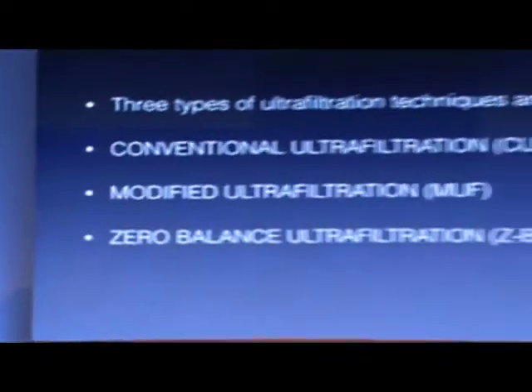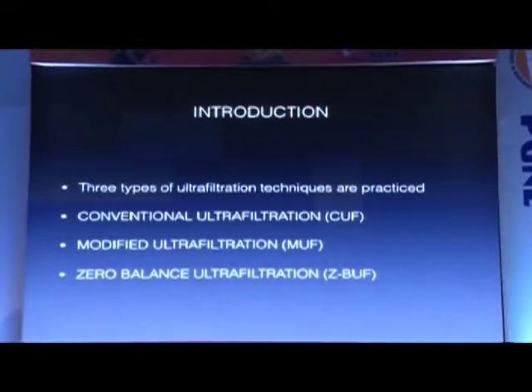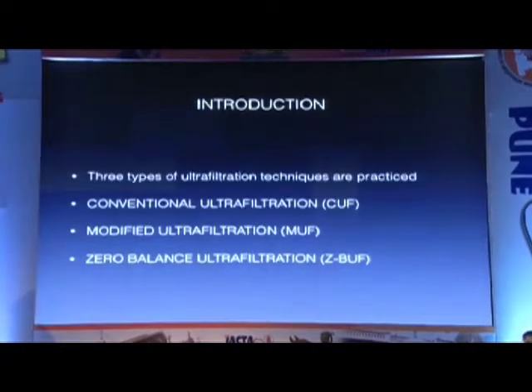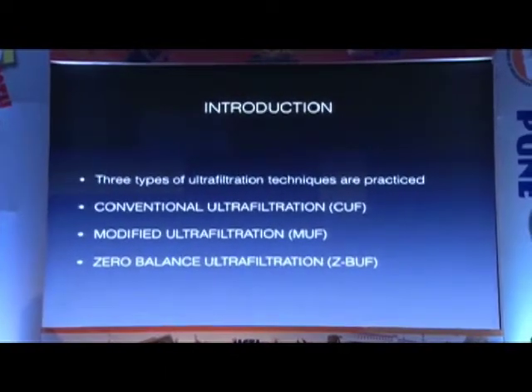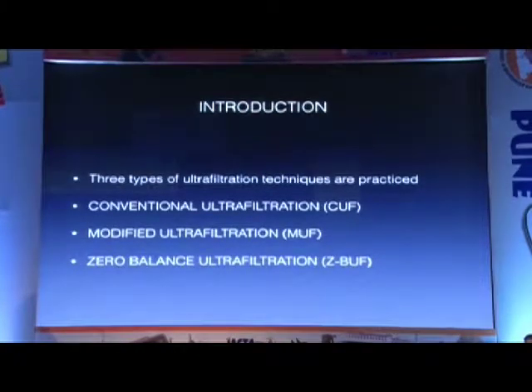So basically, we know that there are three types of ultrafiltration techniques which have been in vogue. Ultrafiltration, to start with, came from dialysis units, and then it was extrapolated onto cardiopulmonary bypass circuits to get rid of excess water and to correct the electrolyte abnormalities. What we have is conventional ultrafiltration, modified ultrafiltration, and zero balance ultrafiltration, which I'll be calling CUF, MUF, and ZBUF respectively.